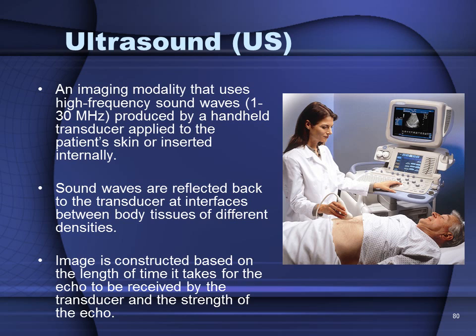These sound waves are reflected back toward the transducer at interfaces between tissues of different density, and an image is constructed based on the length of time that it takes for the echo to be received by the transducer, as well as the strength of the echo. The image then is projected onto a screen where it can be annotated and saved for later interpretation.